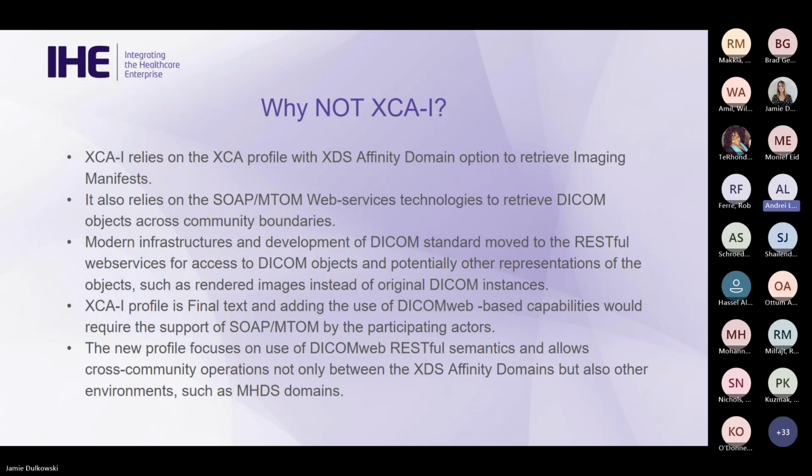So the new profile, the XC-WADO, focuses on the use of DICOM web RESTful semantics and allows cross-community operations not only between the XDS affinity domains, but also other environments such as MHDS domains or whatever may be a future development in configuration of the healthcare communities. Next slide, please.